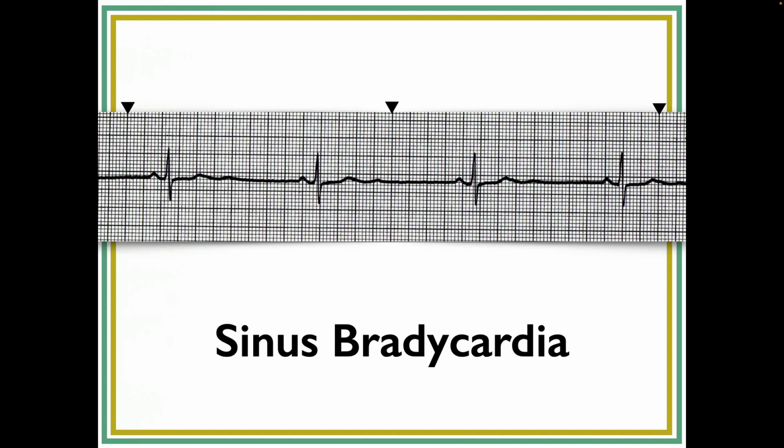Riley, what are these here? Here's our P wave, QRS, T wave. What's this thing? The U. It's the U wave. Okay.